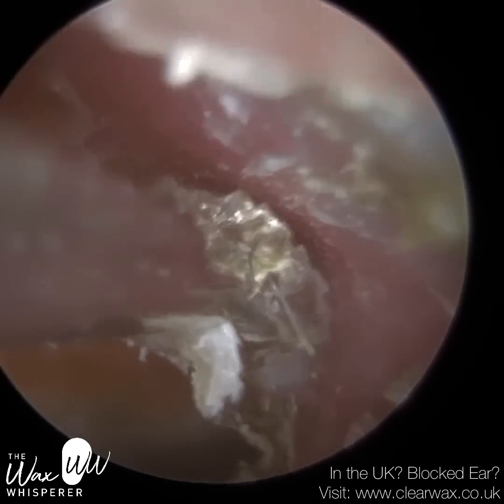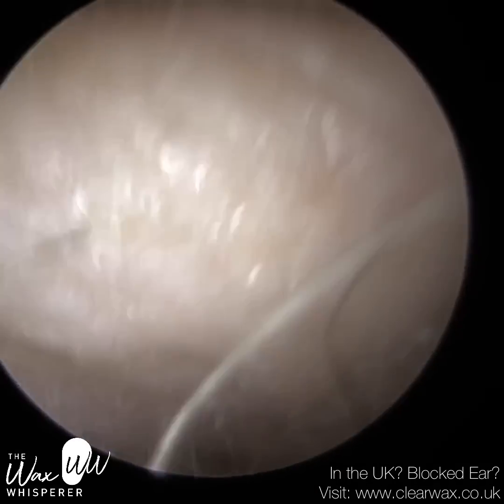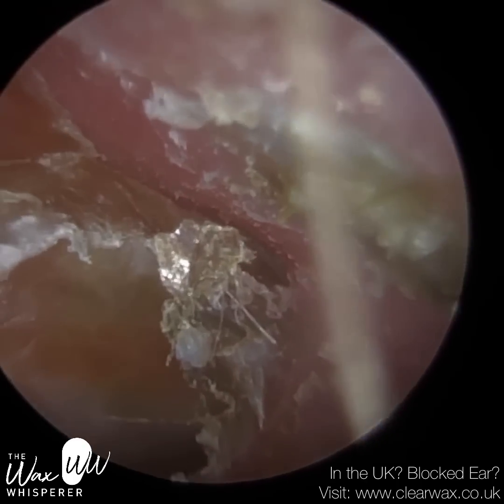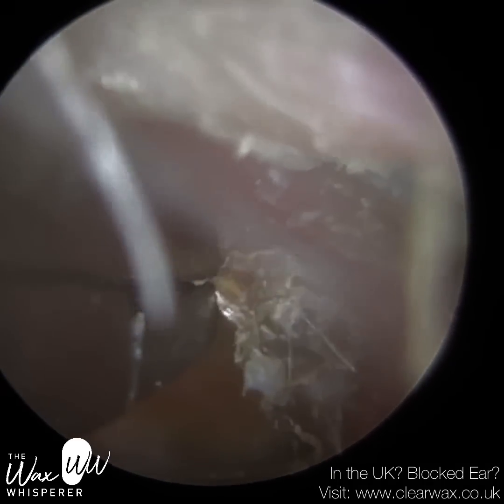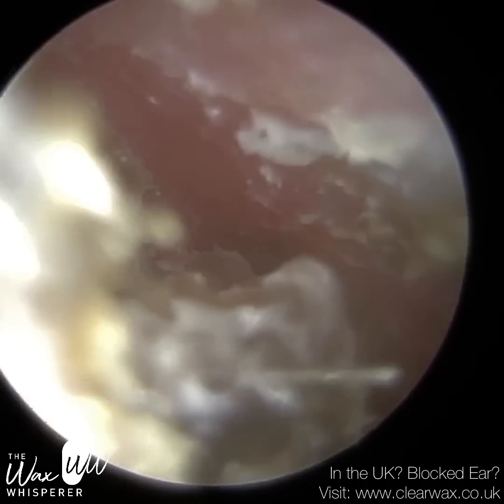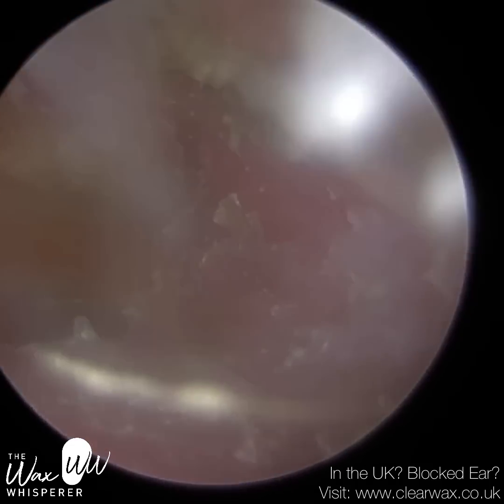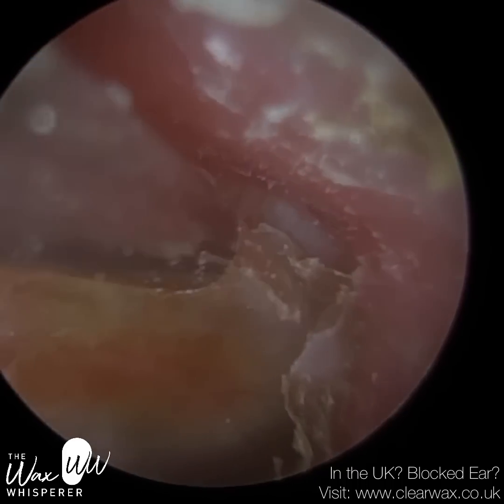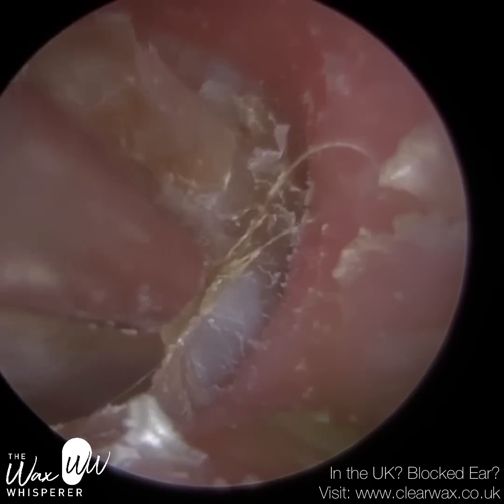The innermost membrane of the eardrum is the mucosa, which also lines the middle ear — it secretes mucus, hence the name mucosa, and we also find it in our nasal passages. The middle membrane is full of fibrous and connective tissue, which gives the eardrum its strength and rigidity. I peeled some skin off the back part of the eardrum and went in with the forceps to try to remove it in one piece. Although I did get some skin off, that was just the first layer — there were multiple layers of dead skin, so there was an undercoat that was a lot tougher.